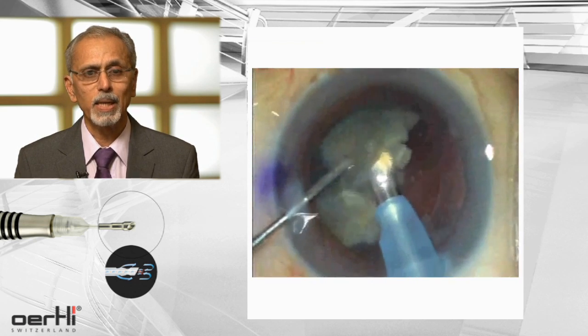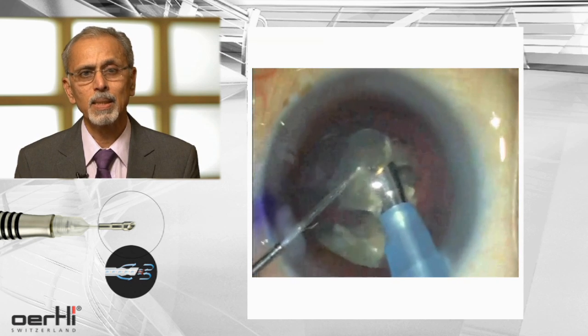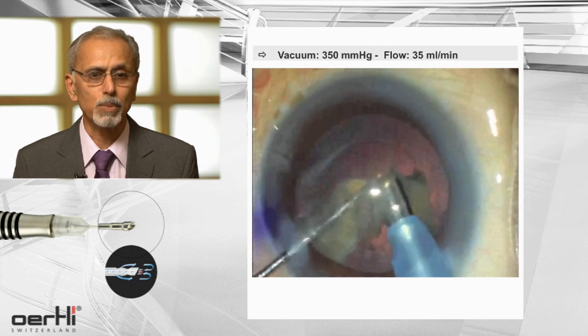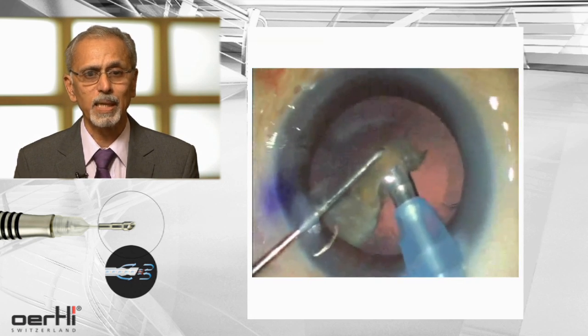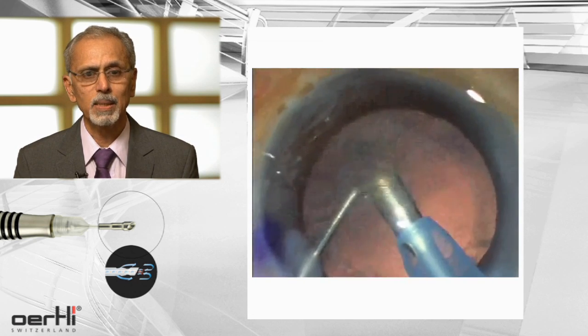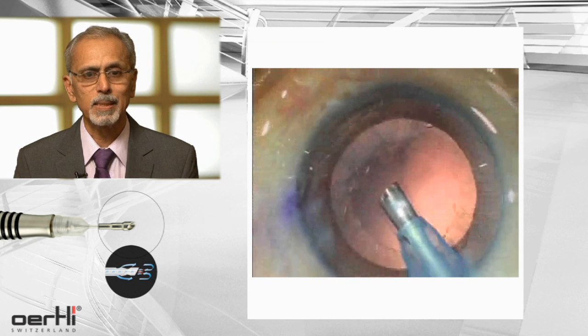At this stage, when I have the last couple of fragments to be emulsified, I would lower my vacuum to around 350 and my flow rate would come to around 35 cc. This is a crucial stage where you have only the last two fragments, but what you have to notice is the kind of stability that FACO EZ-Tip offers you in this particular case.